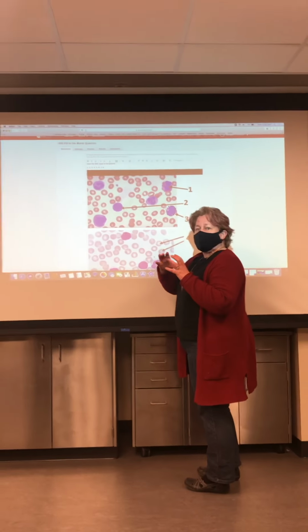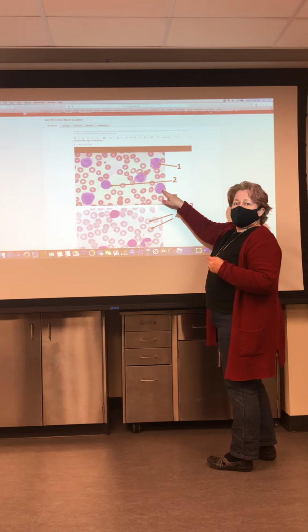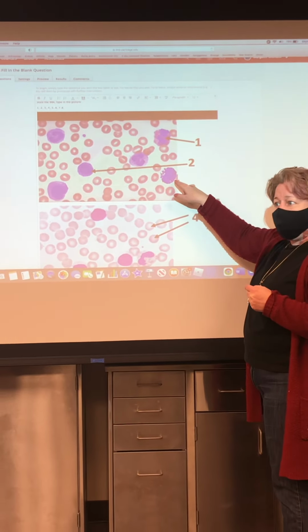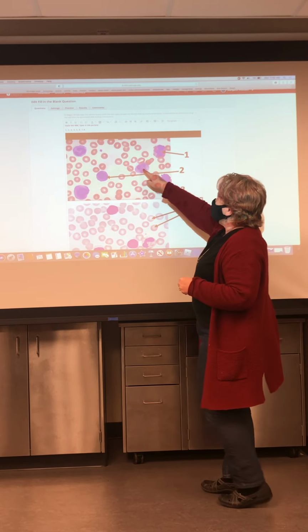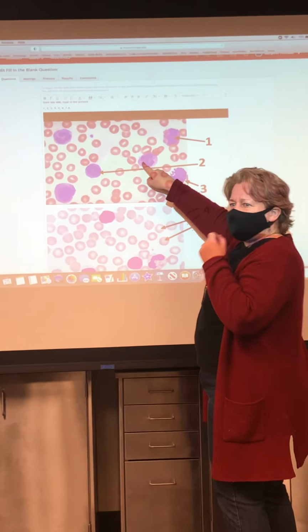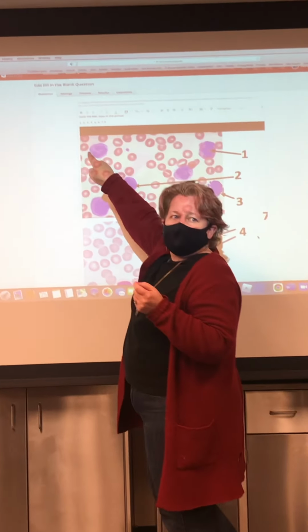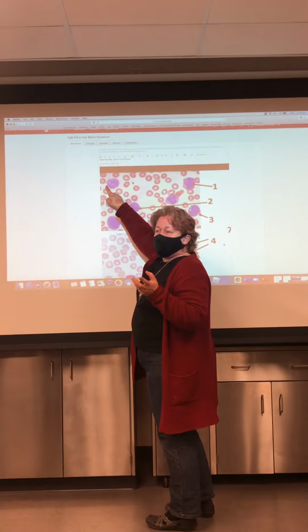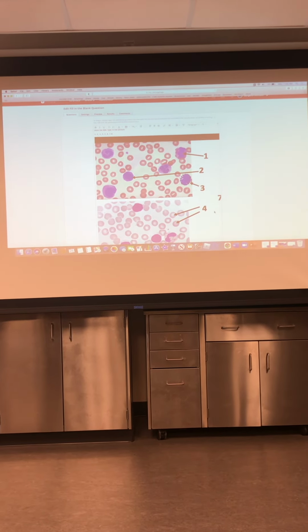Lymphocyte, because it's got that big old nucleus inside of there. I would say this is probably a basophil, which is a really rare find because it's just got all those punctate granules in there. Most of the cells that you look at like this are going to be neutrophils. You're probably going to be identifying something like this as an eosinophil. Likely that it's actually a neutrophil, but either way is fine. There's just not that many eosinophils.